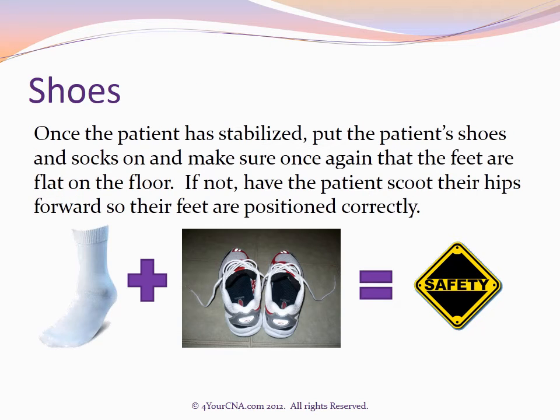Once the patient has stabilized, put the patient's shoes and socks on and make sure once again that the feet are flat on the floor. If not, have the patient scoot their hips forward so their feet are positioned correctly.